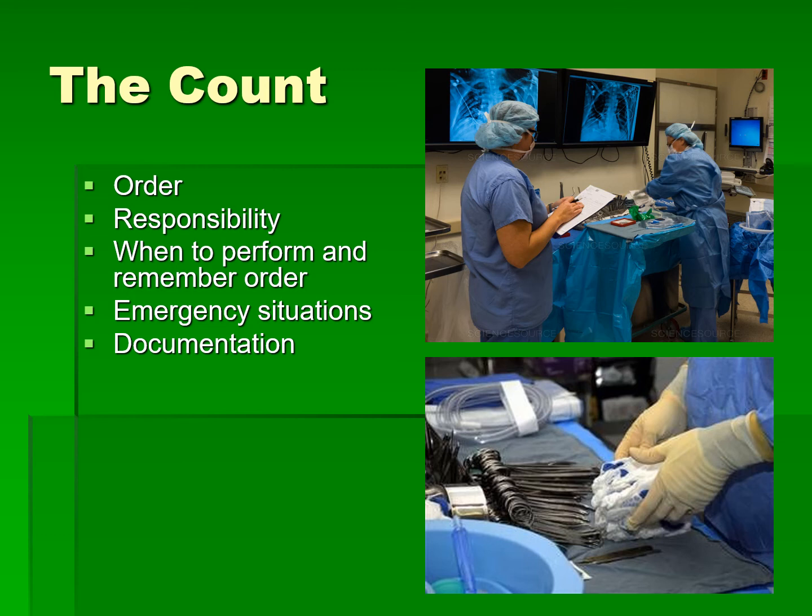Let's see. Some fancy facilities have counting systems where the items are barcoded, or they have little radio frequency devices sewn into the sponges and those kinds of things. So there are some counting systems out there that are being used for checks and balances as well.